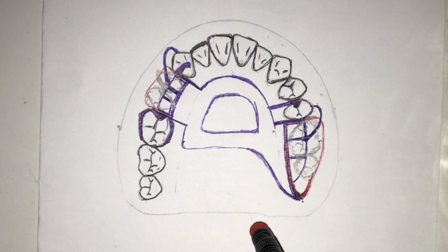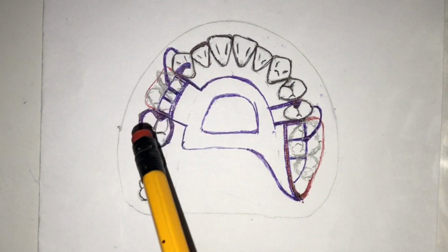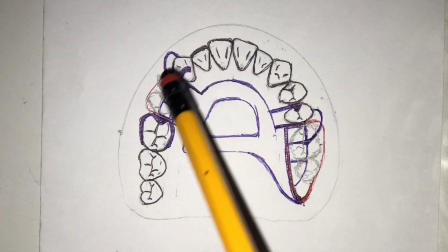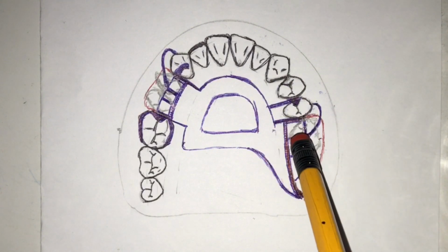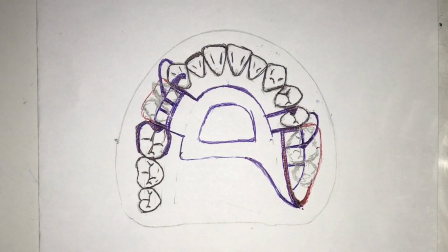Anyways, if you're going to ask, since it's a distal extension case, where your indirect retainer is located, because I told you, by the way, your direct retainers of choice are already what? An I-bar to the canine, a circlet in the molar, and an I-bar or RPI to a second premolar. If we're going to ask, where is the indirect retainer?